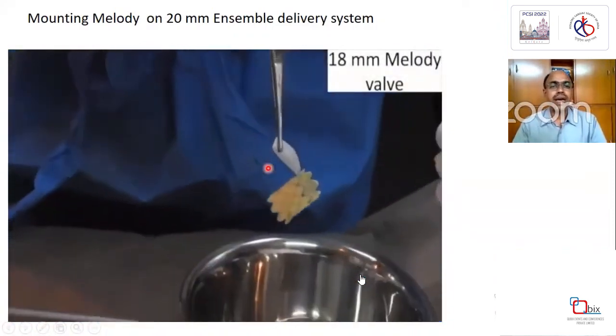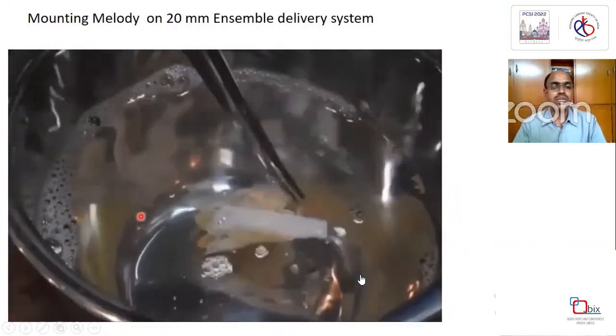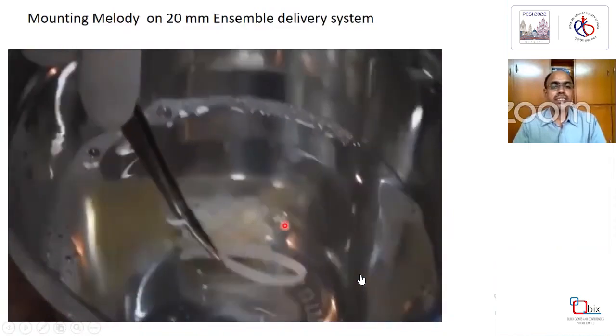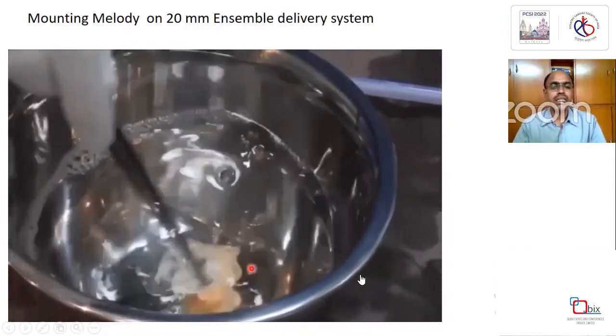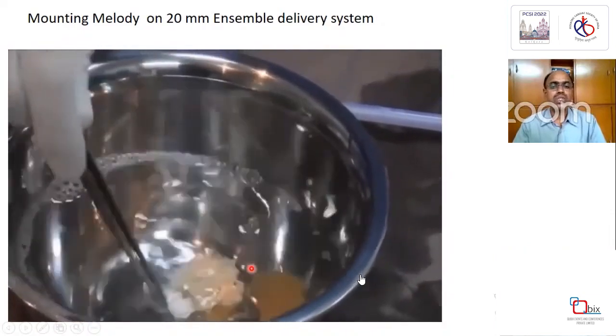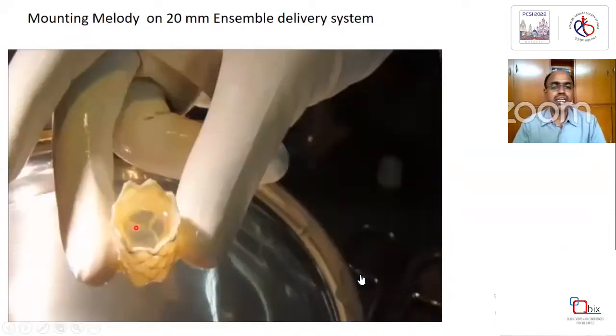An 18 millimeter Melody valve is taken. The glutaraldehyde solution is removed. It is washed serially in saline, each wash for about 1 minute and in about 5 bowls, so that all the glutaraldehyde is removed. We check the integrity of the valve.